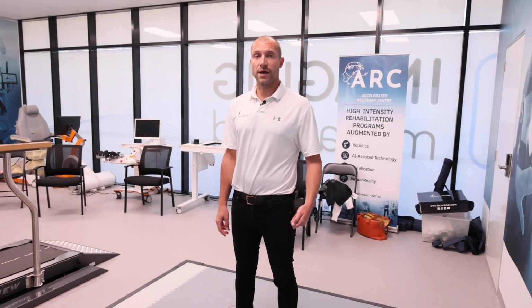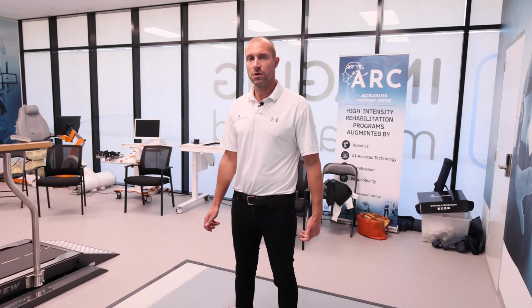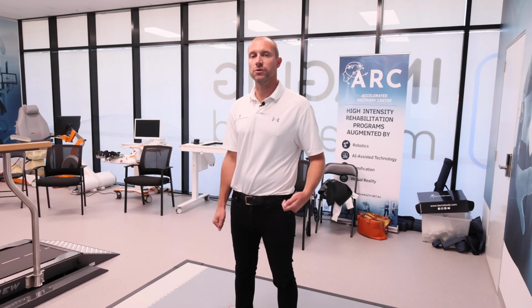We are having a look now at a different exergame called the Move. This time we have the opportunity to work with our patients on the dynamic balance all around the gray area on the ground of the D-Wall, with different kinds of speed and movements. This is going to promote dynamic balance, strength and endurance.